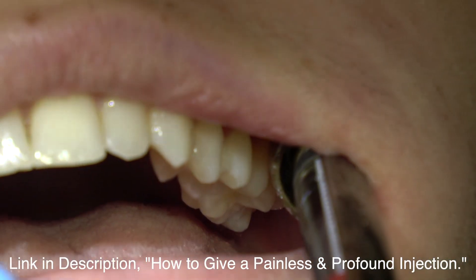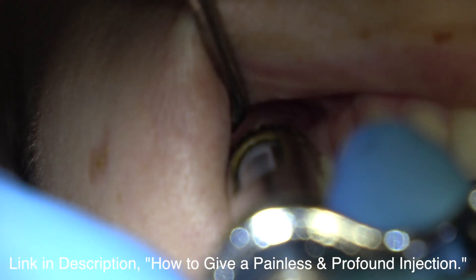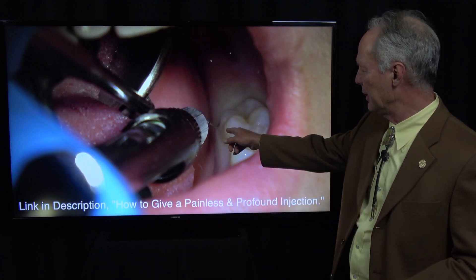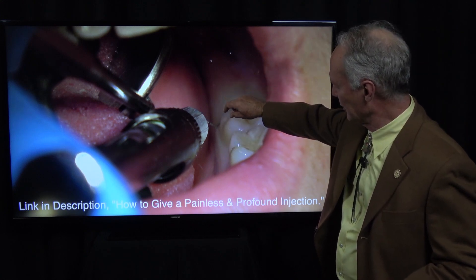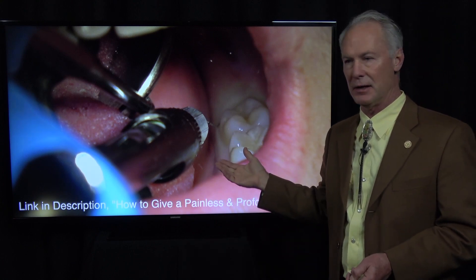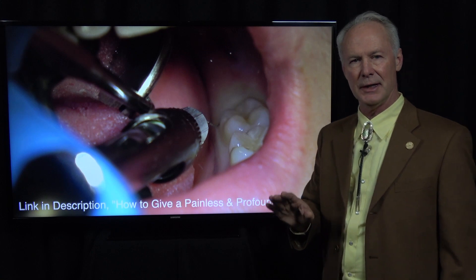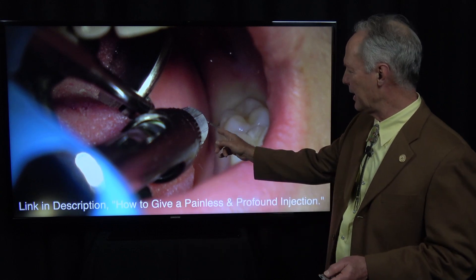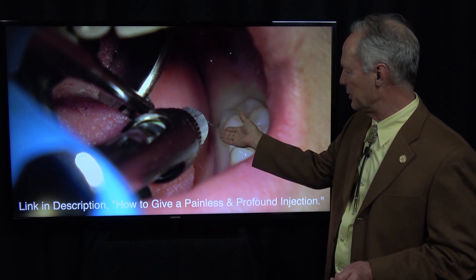Local anesthesia — a block on both sides — inferior alveolar nerve block. It's very important when you're extracting a tooth, doing endodontics, crown prep, or something significant, that you give an intraligamental injection. I'm injecting into the mesial intraligamental space of that wisdom tooth. I want it dead numb. Most of the time these patients are going to be sedated, but you still want the tooth to be dead numb. You're usually not going to get profound anesthesia unless you give an intraligamental injection. That's a 30-gauge needle with the bevel pointed toward the tooth you're anesthetizing, and just moderate pressure for about 20 seconds — and the tooth will be dead numb.